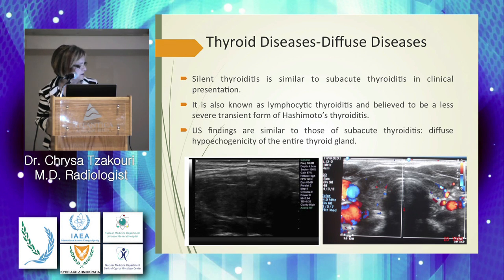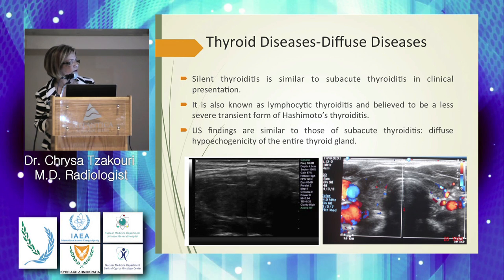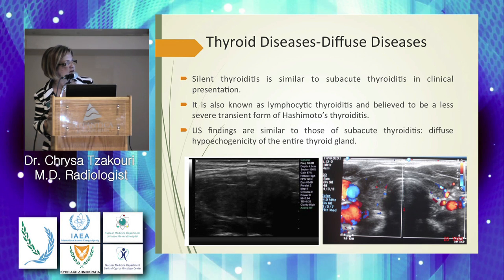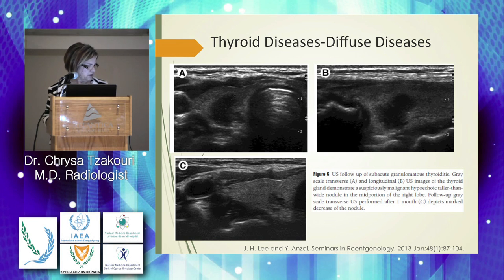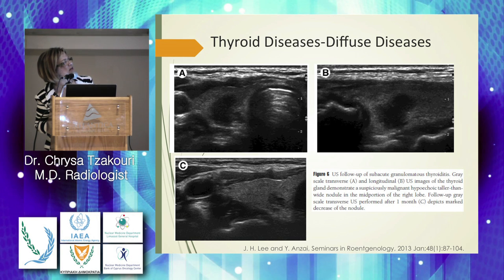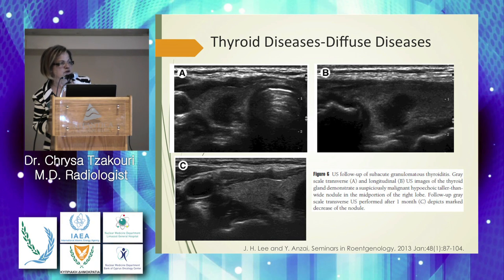On imaging, thyroiditis appears as a dark, hypoechoic region. On Doppler imaging, very low vascularization is seen within the hypoechoic areas. Another case of thyroiditis shows on transverse grayscale imaging a local hypoechoic lesion in the thyroid, confirmed as hypoechoic on longitudinal imaging. On one-month follow-up study, the lesion was reduced, confirming the diagnosis of thyroiditis.